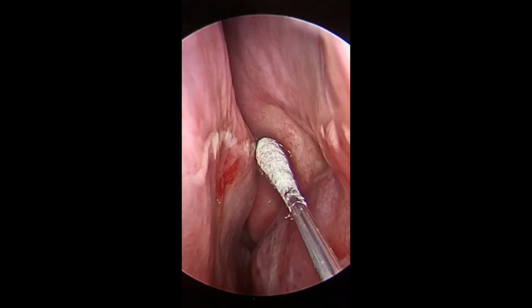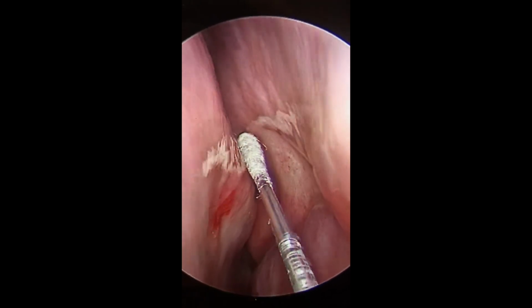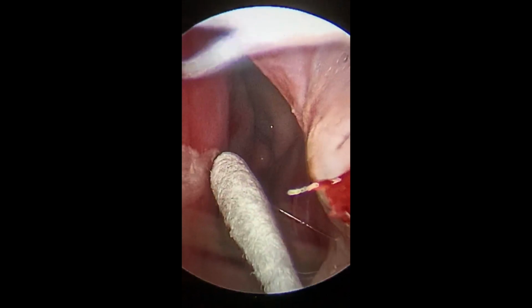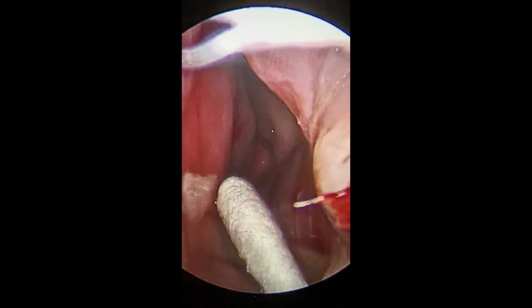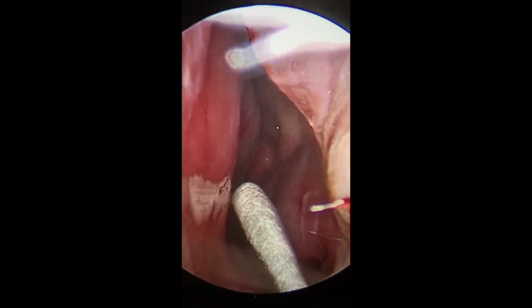This is an example of a swab that is angled too steeply entering the nasal cavity. At this upward angle, the swab will not reach the nasopharynx as it is too vertical. Here we see the swab impacting the nasal septum. This is both uncomfortable for the patient and in the incorrect orientation.